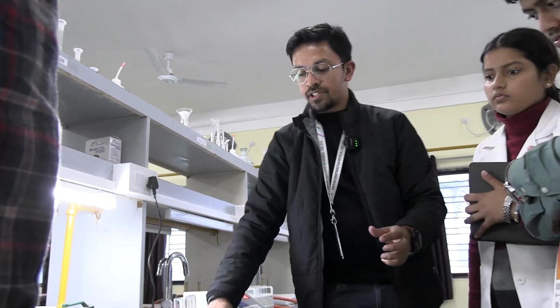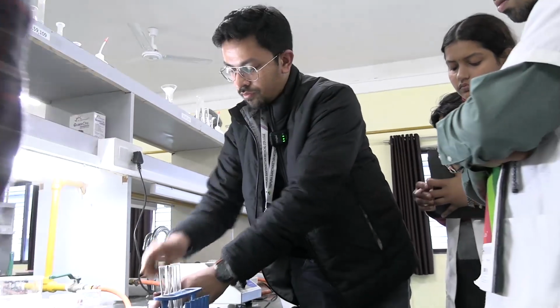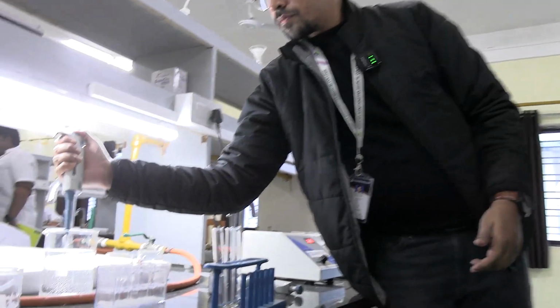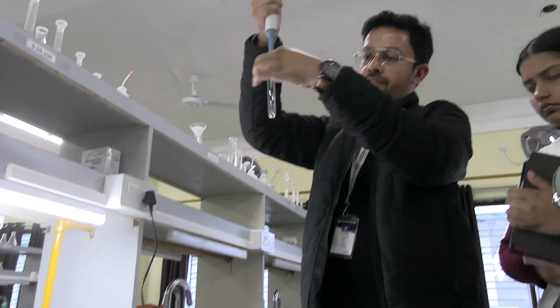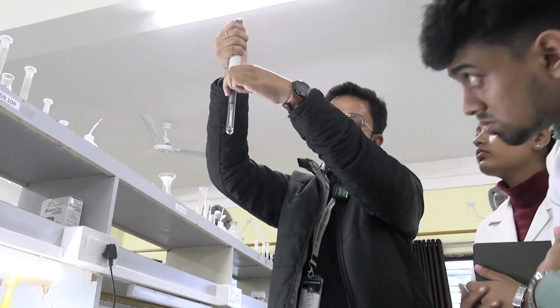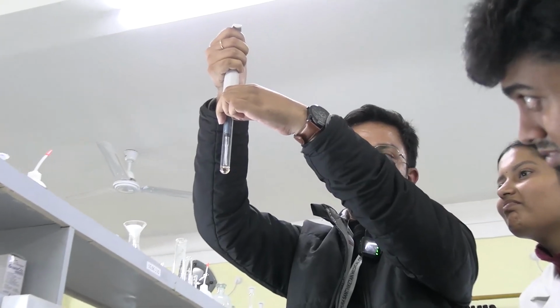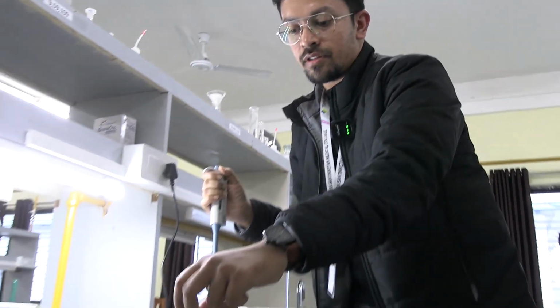Okay, 3 samples taken from the GOD-POD reagent. Now we have to first take the distilled water. Took the distilled water, take the test tube. First see from here how much is the amount. See, this much amount you are doing with, that's all. Take out the test tube. Done. Mix it, keep it here.